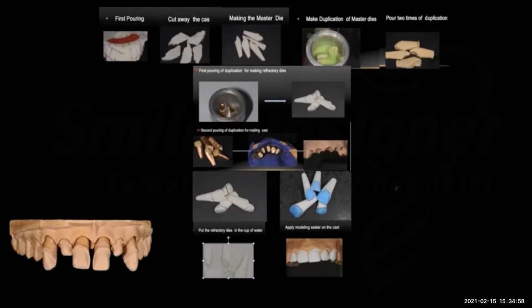For having a healthy gingiva, physiologic contours or emergence profiles are important. Over-contoured restorations can lead to gingival inflammation. For these reasons, a gingival mask cast or soft tissue cast is the best technique for the ceramist, because the ceramist works on a master cast with the gingival elements. For reasons of time, I cannot talk about how to make this cast for feldspathic laminate veneers. If anybody wants to know about this topic, send an email or direct message on Instagram, and I will send the PDF of this topic.